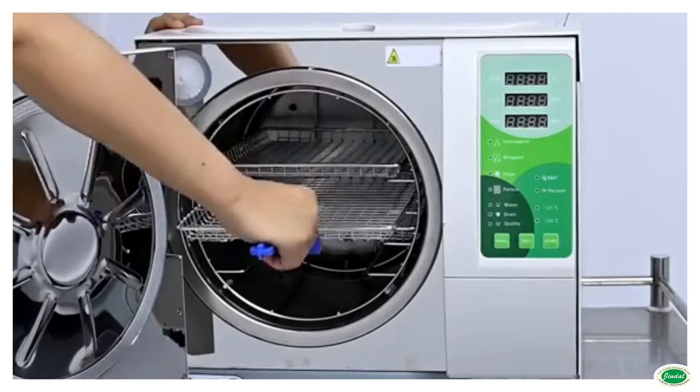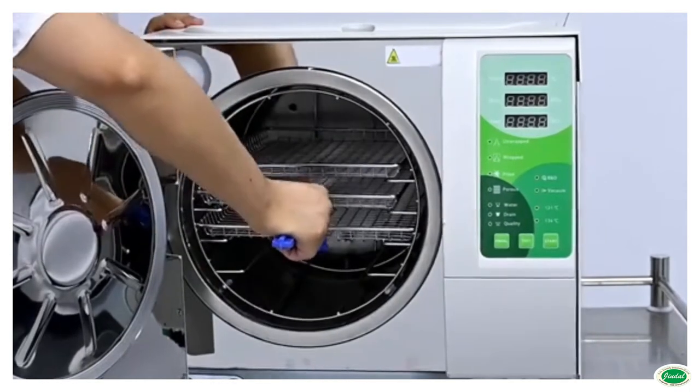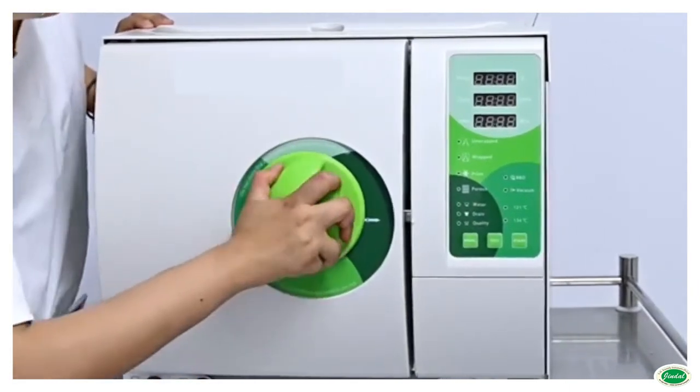The ergonomically designed square structure provides an elegant look to the equipment. The chamber, shell, lid and other parts are made of high-grade SS304 stainless steel.